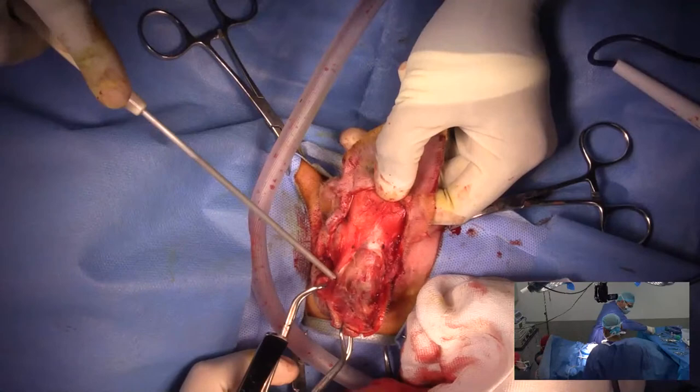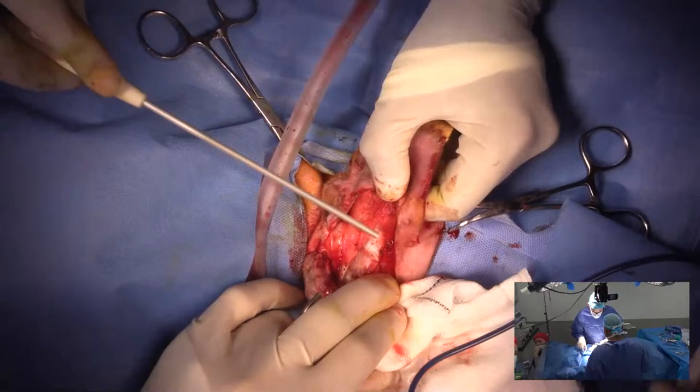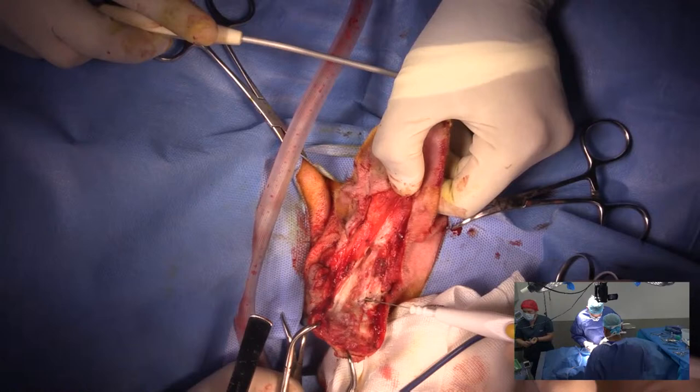My scalpel blade here. I'm happy to use cautery until I get to the angle of the demarcation between the vertical and horizontal ear canals. And then I'm going to switch just to sharp and blunt dissection and no electrocautery. The reason why I do that is because I'm getting closer to the facial nerve. And so I'm going to obviously try to avoid that.